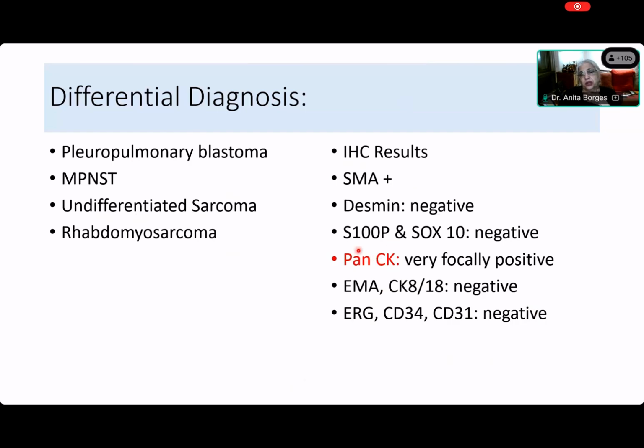It has got some focal pan-CK. Can it be? And we just saw a synovial sarcoma in the chest wall. Yes, ma'am. So can it be a synovial sarcoma? Yes, ma'am. Just like Priyamada. Okay. Aditi, is Aditi there or she's left? Diksha, can this be a synovial sarcoma? No, ma'am. Why? Lot of necrosis. Because there is huge amounts of necrosis.